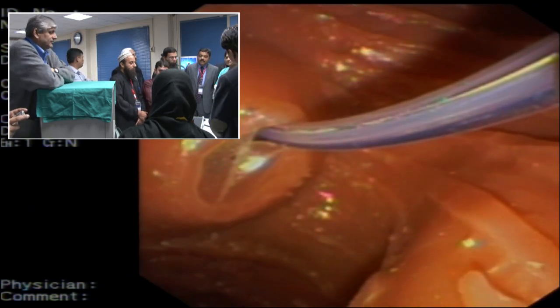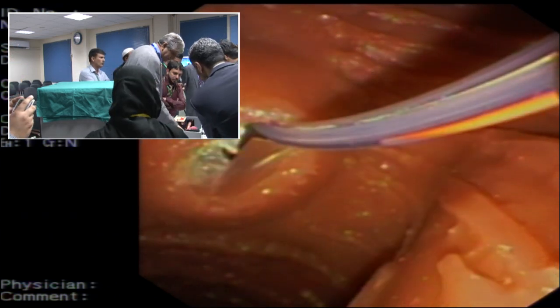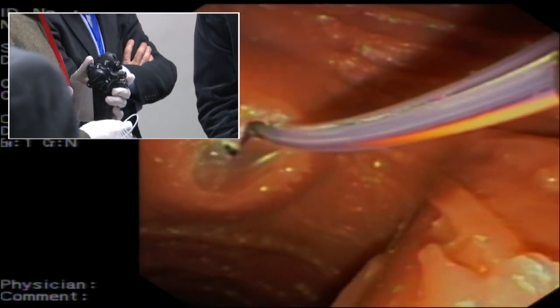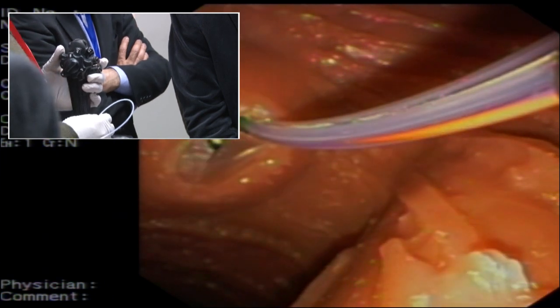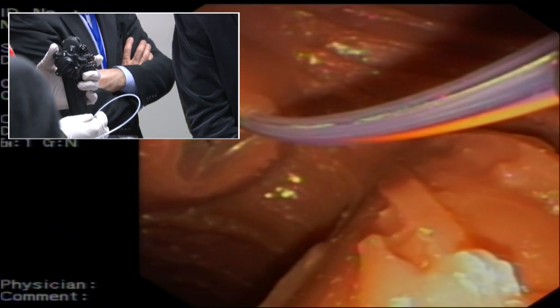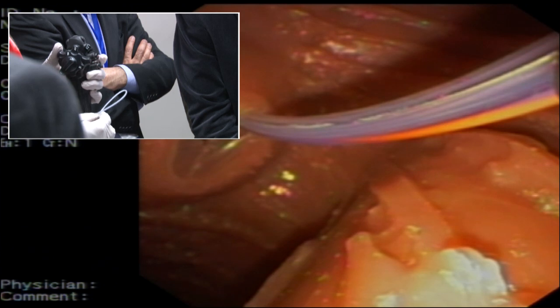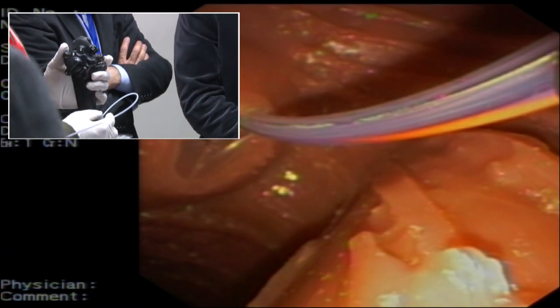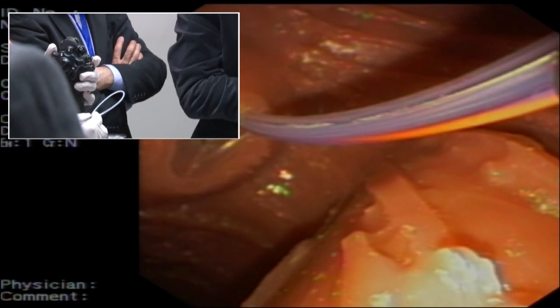हाँ ये भी गार्ड बार चार आगे बाहर निकलेंगे. अभी आ जाएगा. So you've got the guide wire. What we should do is just first let them each practice movement and movements, understand these basic, very basic things, but with all the experience we have, the most important thing in doing ERCP. ठीक है ना, तो उसको करें.